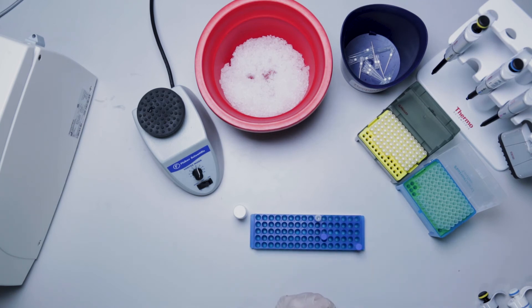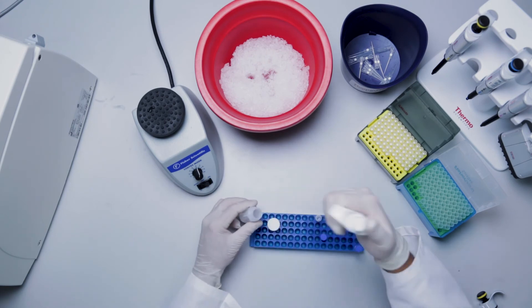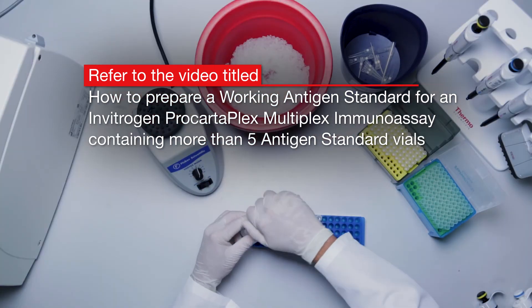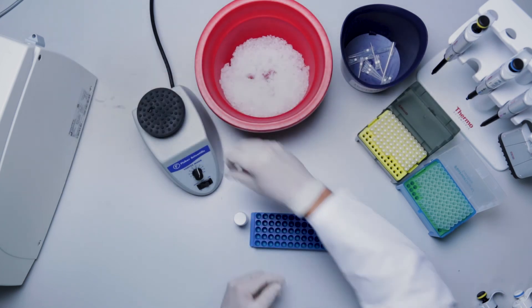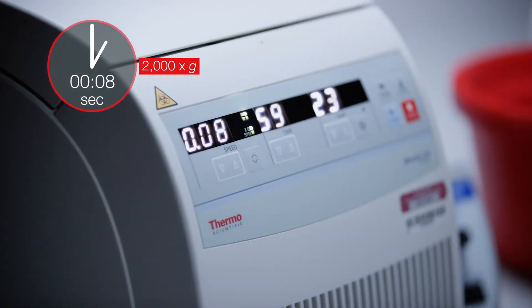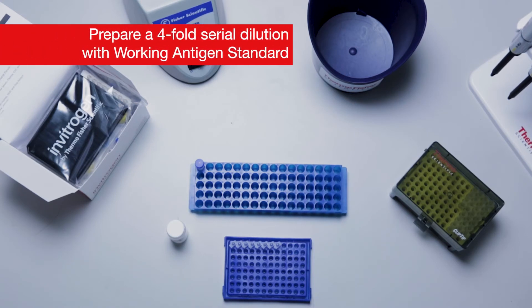For details on how to pool more than five antigen standard vials while not exceeding 250 microliters, refer to the video titled 'How to Prepare a Working Antigen Standard for an Invitrogen ProCartaPlex Multiplex Immunoassay Containing More Than Five Antigen Standard Vials.' Vortex the working antigen standard vial at high speed. Centrifuge at 2000 g for 10 seconds.